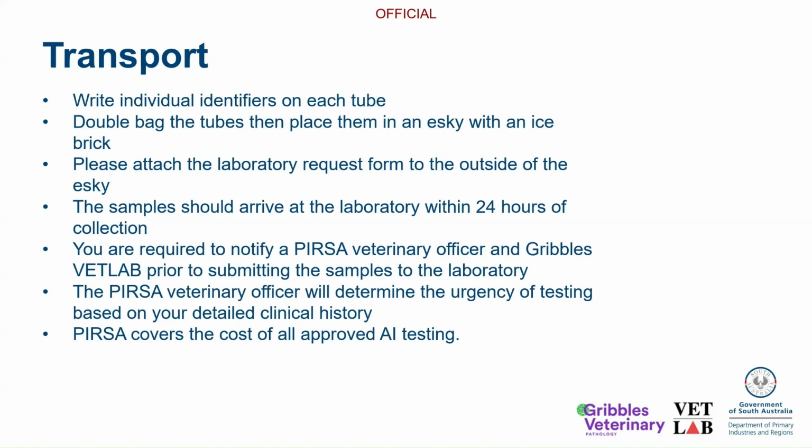The sample should arrive at the laboratory within 24 hours of collection. If that is not practical, it's really, really important that you contact us, please. And we will make sure that we put in place a collection process so that the samples are collected within 24 hours. If you are collecting on the weekend, it's important to coordinate through the EAD hotline, please, because we can organise to receive samples out of hours. This is in the case where you suspect HPAI, an exotic disease.